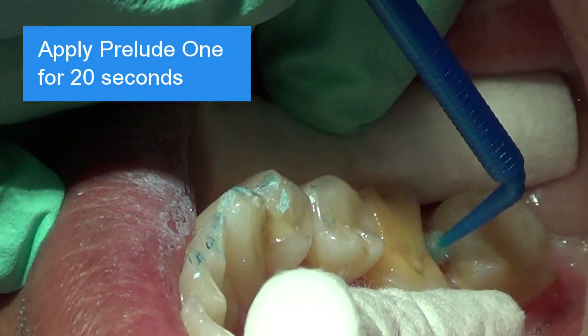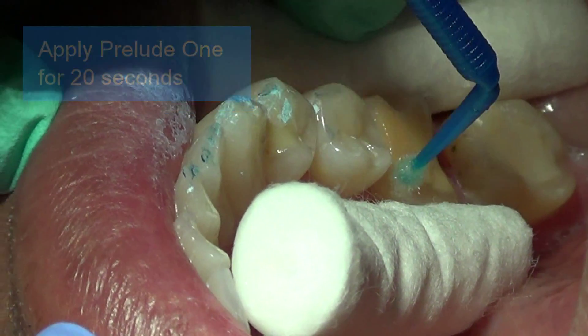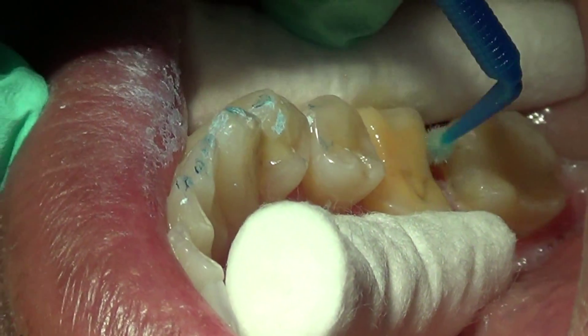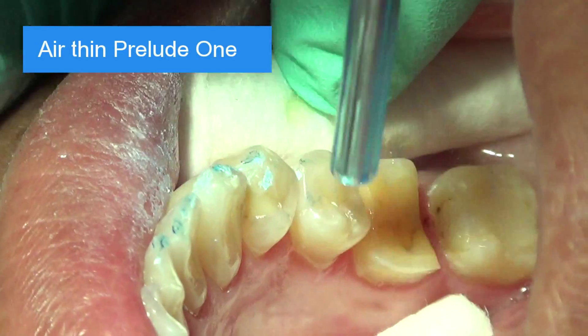Apply Prelude 1 thoroughly and liberally again for 20 seconds. Air thin Prelude 1 so no ripples are seen. Remove all the excess.